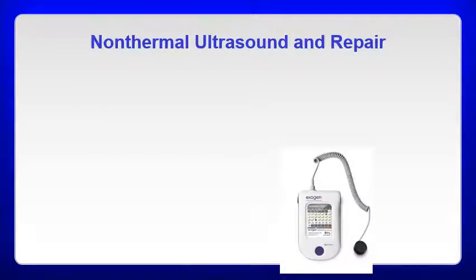Okay, non-thermal ultrasound and repair. So with pulsed ultrasound, again, they call it non-thermal. Technically, you will get a mild temperature increase because it's still ultrasound energy. You're just going to get less relative to what you would get. So essentially, the reason why they say it's non-thermal is because the goal of your treatment is not to use the heating effects of ultrasound, but what you're trying to do is utilize the mechanical effects.